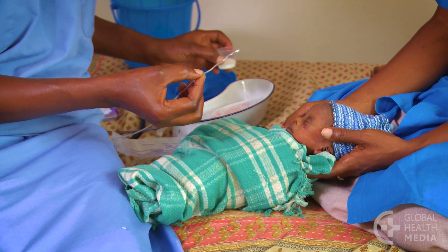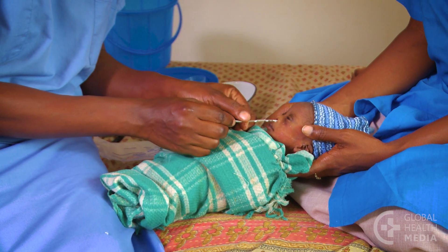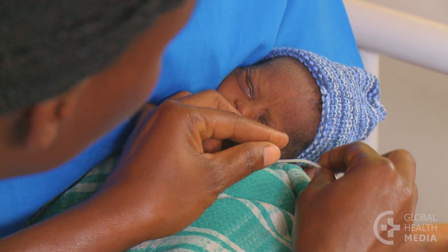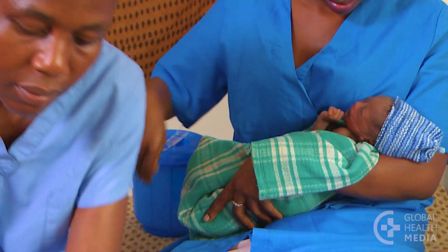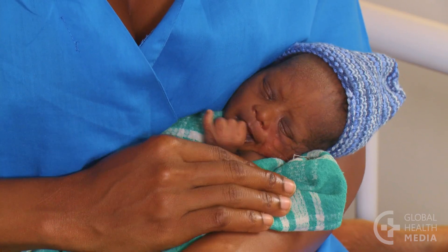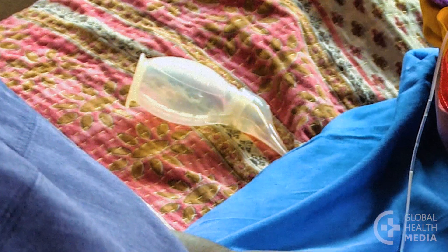Tubes are usually replaced every seven days, alternating between nostrils. To remove the tube, pinch it closed and pull it out quickly. Have a suction device available to remove excess mucus from the nose if needed.